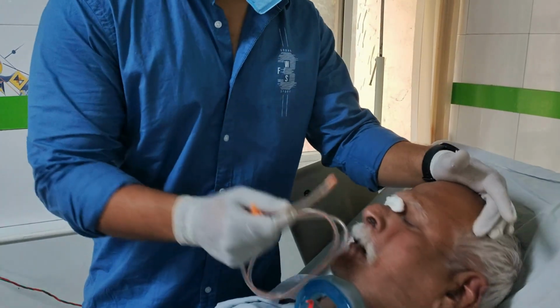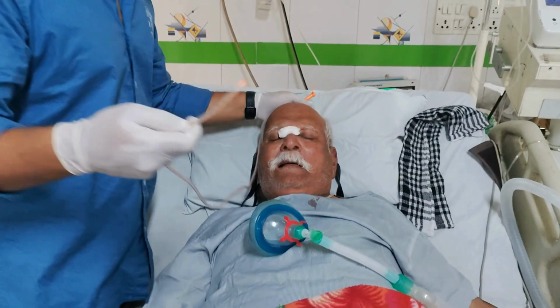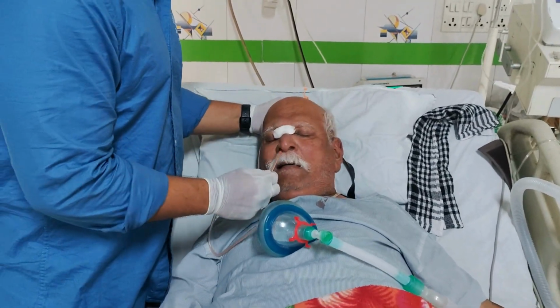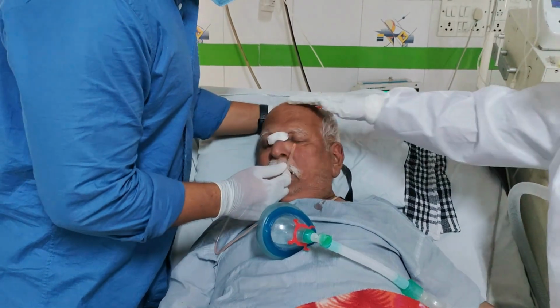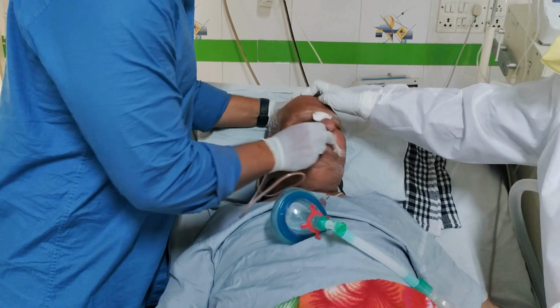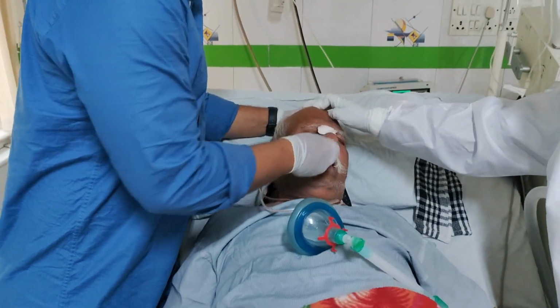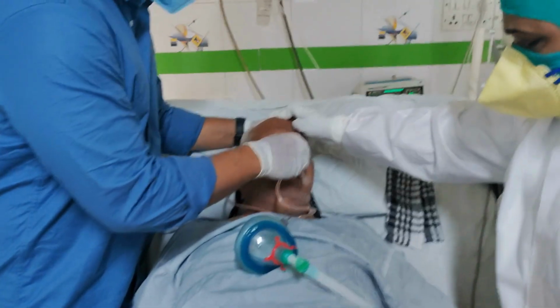When you're ready, start by gently inserting the tube into the nostril. Aim towards the ear on the same side of the nostril to follow the natural curve of the nasal passage. This part can be tricky with an agitated patient. They might gag or try to move away. If they gag, pause for a moment, reassure them, and encourage them to take deep breaths.